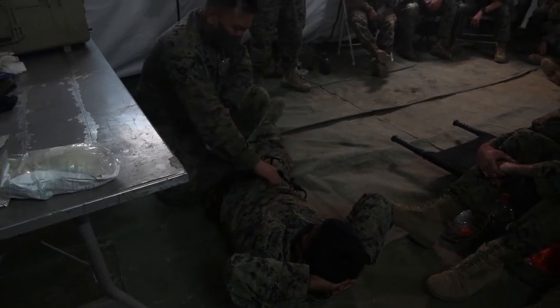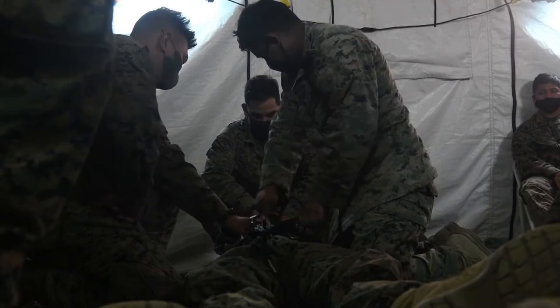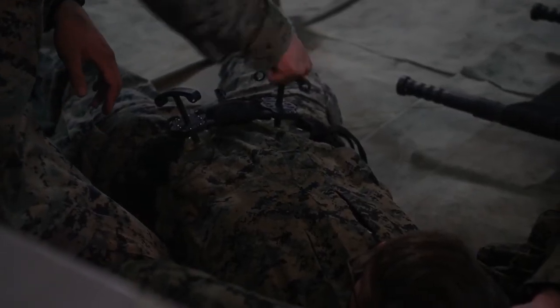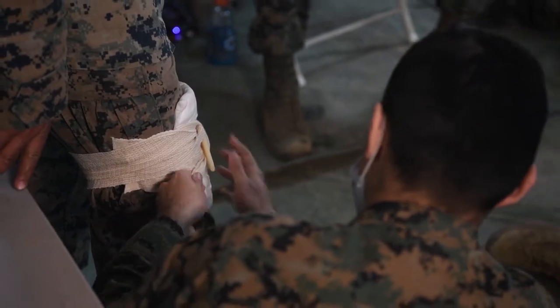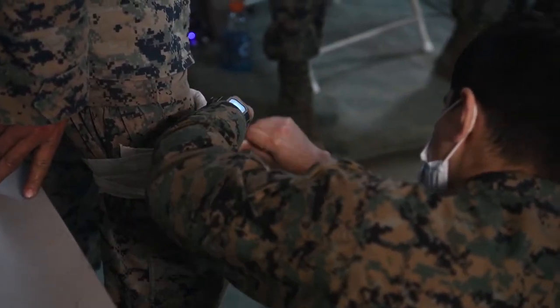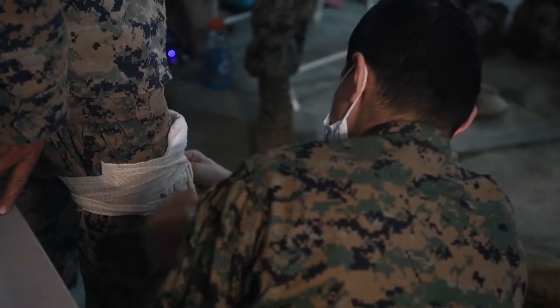After you place it, you have to wrap it through the windlass like so, and then you hold. You see the other side. What that does is it requires more pressure to the wound.